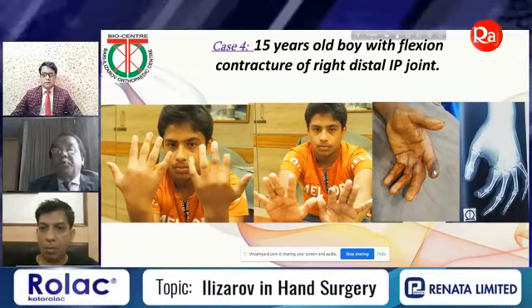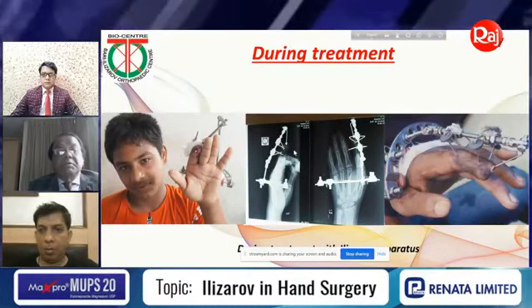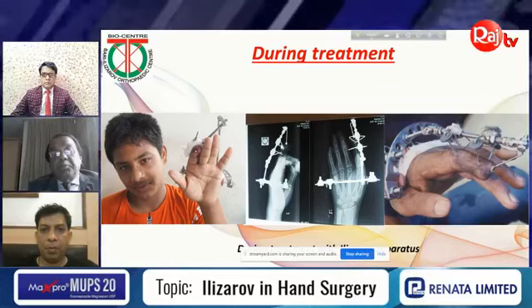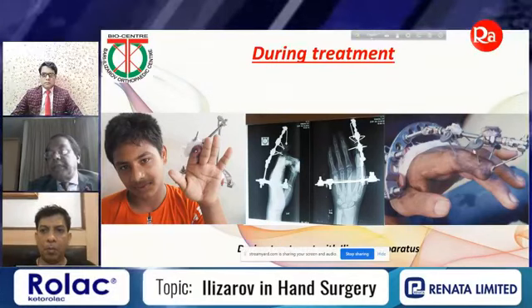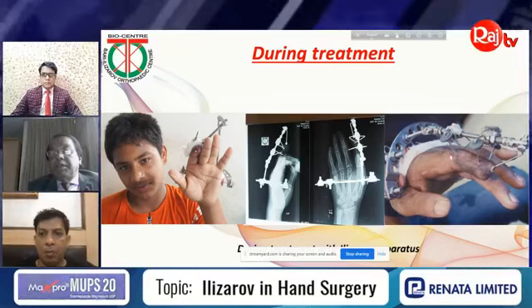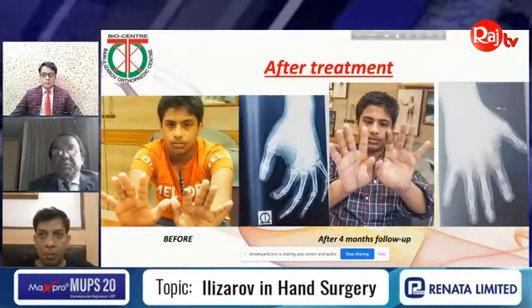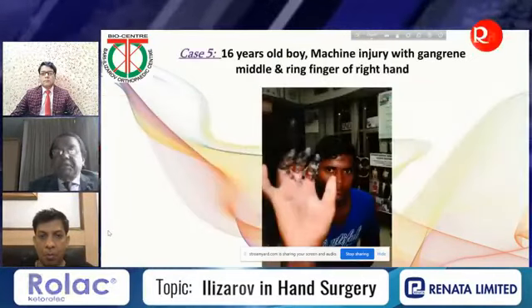Then I started fixing with mini fixator. What I have done, you can see here, just one bow here, mini fixator, and here the distal part was angulated. I put 2 wires here, 2 fixation and olive. Gradually I pulled this one distally, and the fixation was like that. The mini fixator, 1 arch, the bow, and then gradually, see, this is almost corrected, almost corrected. Before that, and this is after.